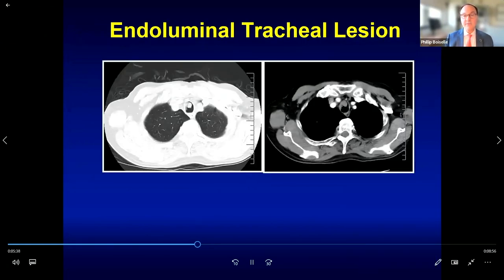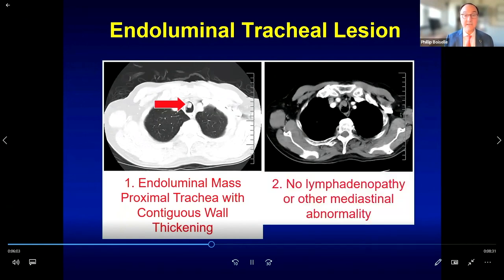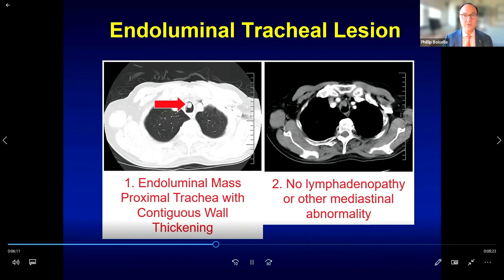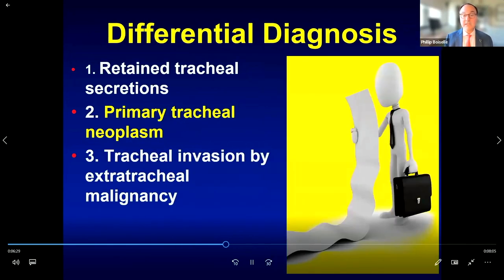Look carefully at the tracheal lumen for any endoluminal lesions. In this case there is an irregularly marginated polypoid lesion arising from the right anterolateral wall with associated wall thickening. Findings include an endoluminal mass with no associated mediastinal lymphadenopathy and no contiguous enlargement of adjacent thoracic structures such as the thyroid or esophagus. This is a primary tracheal neoplasm — the majority are malignant in adults; this was a squamous cell carcinoma associated with cigarette smoking.